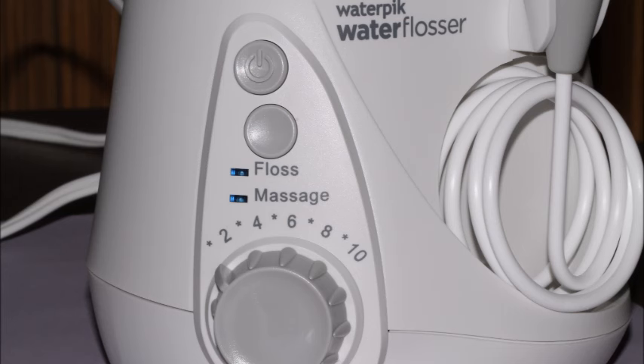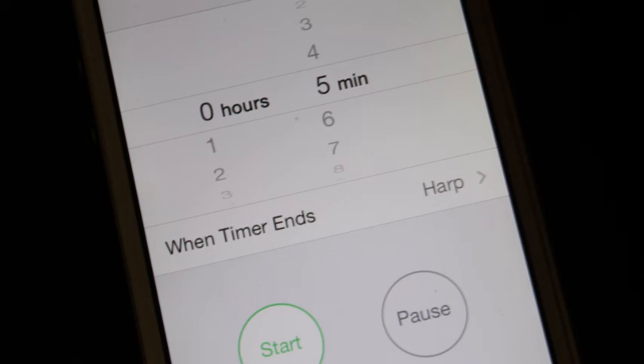If you're using this model, set it to floss rather than massage, and set the power setting pretty low — usually around a 2 or a 3 with this pickpocket tip. You'll need to develop your own sense of feel, but you don't want it so strong that it has a stinging sensation on the gums. The goal is not to reach the highest setting you can, just to reach a setting that effectively gets under the gum line. It's important that you go slowly — a hurried job will not be effective at all, and will give you a false sense of security.